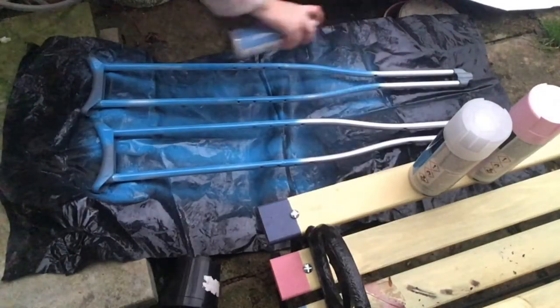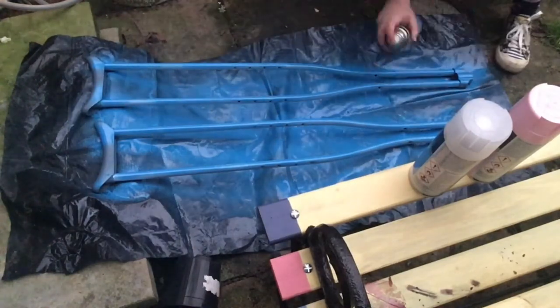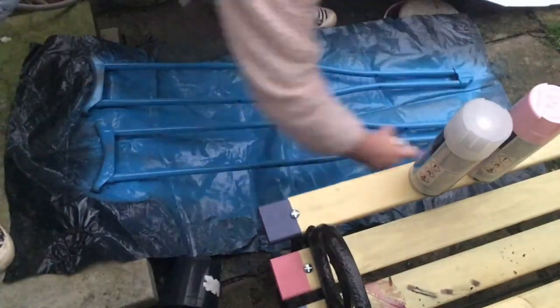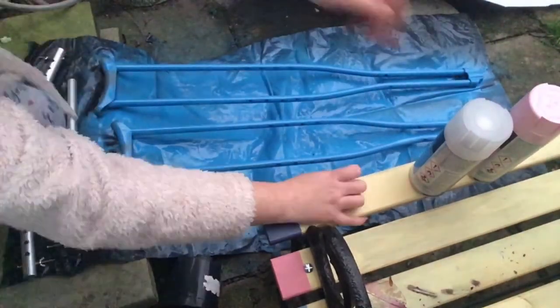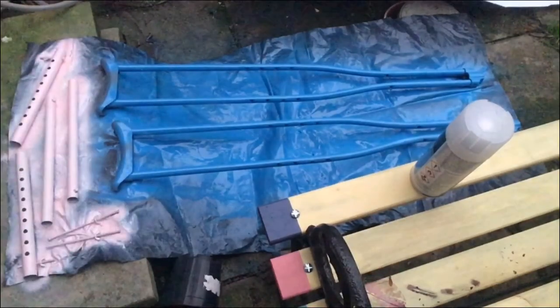Do a few test sprays first to clean the nozzle and then apply thin coats in straight lines down the centre and then coming from both angled sides as well, to make sure you cover all of the top side of the crutches. Then lay out the remaining pieces that you want in a different colour and spray those. I wouldn't recommend laying them flat like this as the paint will pull.